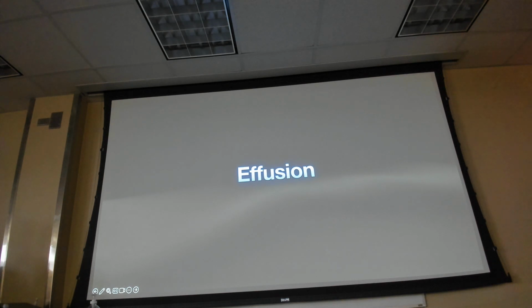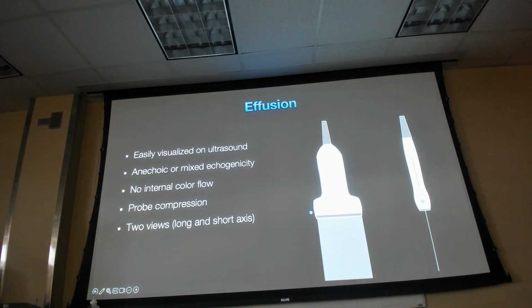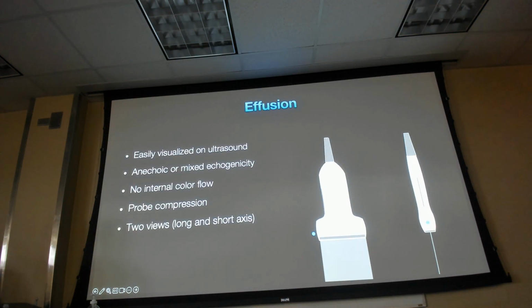Effusions. When might this be helpful? Do we care about just swelling of a joint? Yeah, we do care. It could be a septic joint. There's all kinds of things, or sometimes we have to actually drain these things. I try not to stick a needle in joints if I don't have to, because we don't want to introduce infection, but sometimes we do, and again, you want to get it in two views, and I'll show you.